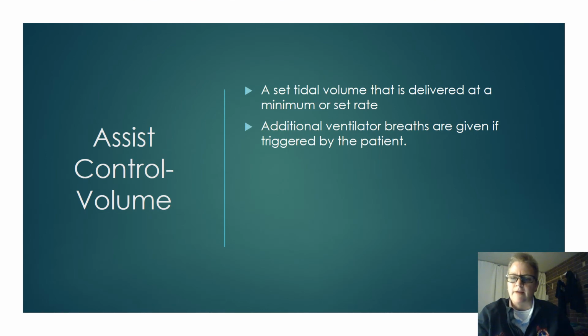Okay, let's talk about this basic mode called assist control volume. And this has been used for years and years in ICUs and in the EDs. It's a great mode. It does have some complications, but basically this set tidal volume that you put in is delivered at a minimum set rate.